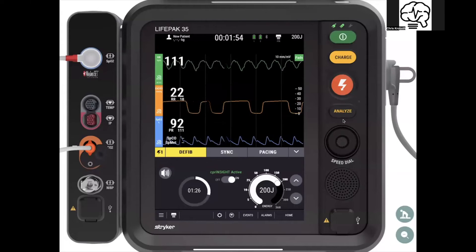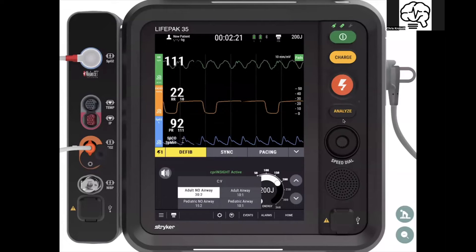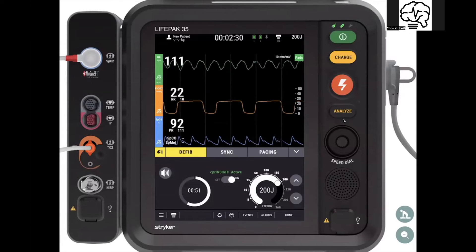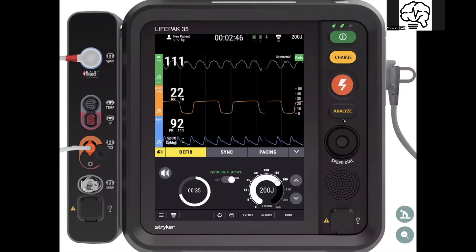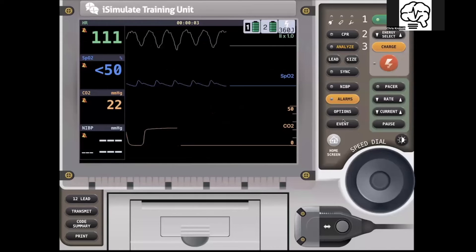You still have the ability to toggle with the arrows or change the dial, so you get both actions. I find it a lot easier to use the arrows as opposed to the dial, but that's personal preference. You have the ability to go into the compression-to-ventilation ratio and change that, just like you could on the LifePack 15. The biggest difference is everything is nice and clean right next to each other.